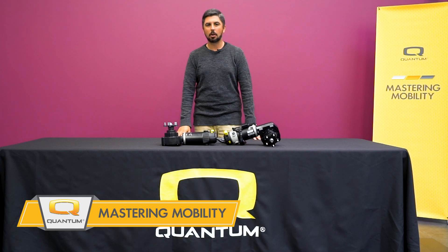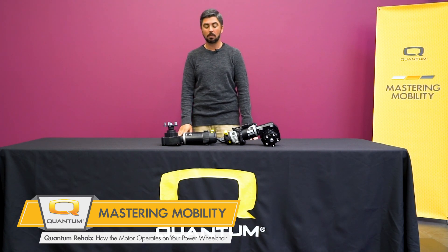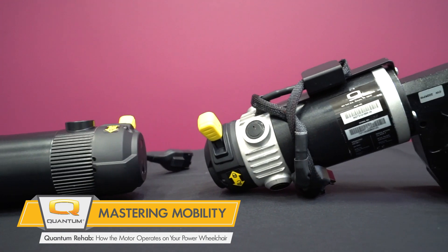On this week's edition of Mastering Mobility, we'll be discussing how motors for Quantum Rehab Power Wheelchairs work. Quantum Power Wheelchairs use permanent magnet direct current motors, two of which we have on display here. A PMDC motor is one whose field poles are made up of permanent magnets.